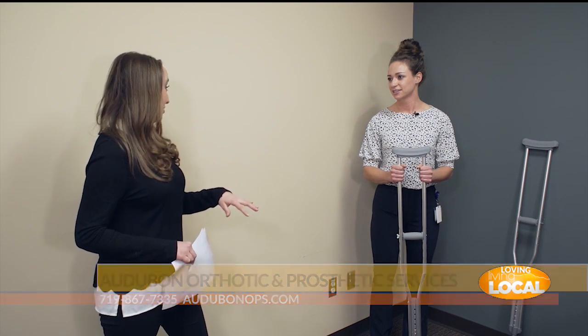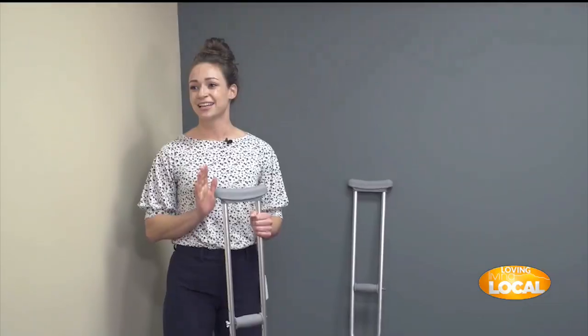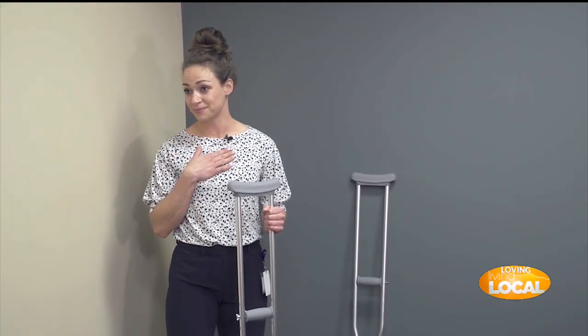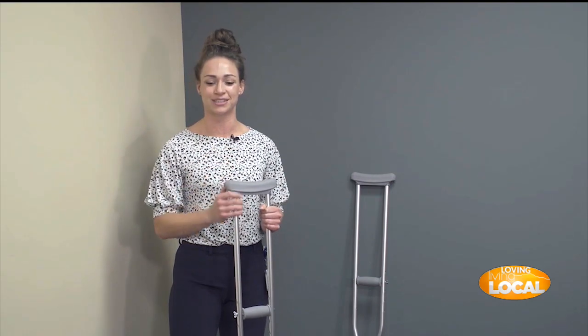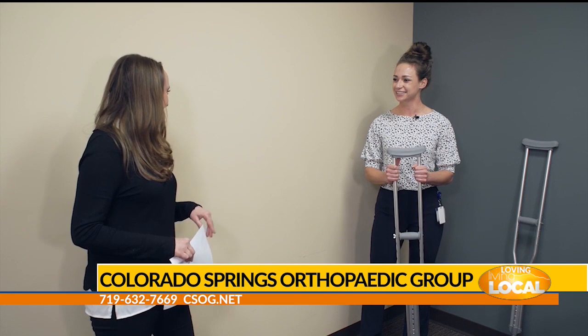For people just starting out with crutches, the advice is: go slow. Don't rush going up or down stairs — even the fitter has fallen going downstairs before. Just listen to your body. For more information on the Colorado Springs Orthopedic Group, visit cSOG.net.